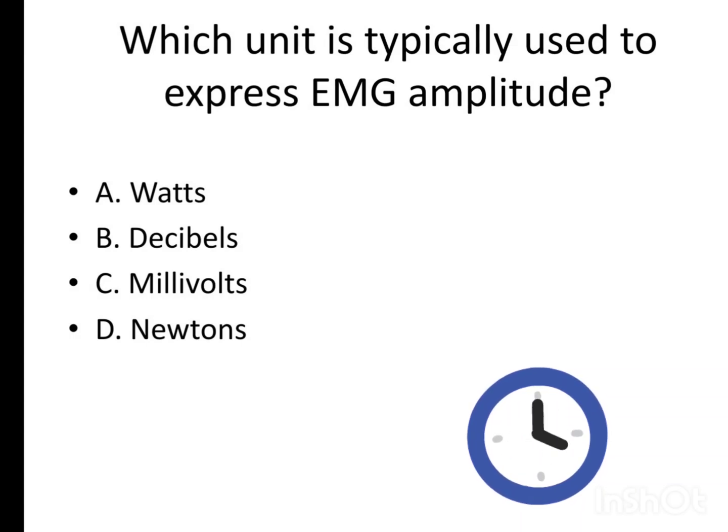If you want to measure the electromyographical amplitude of a particular muscle, what are the units of amplitude? Watt is related to power, newton is related to force, and decibel is related to sound. So millivolt is the correct answer.